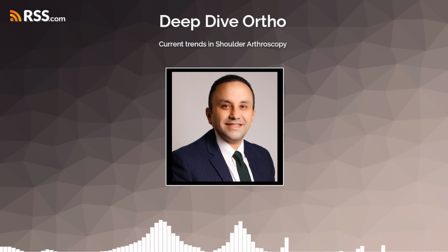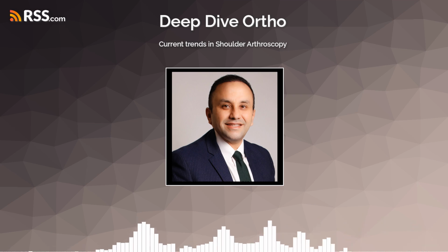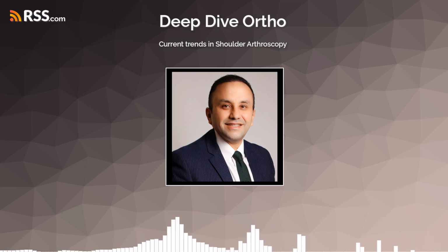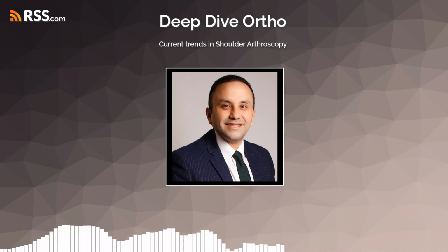They allow us to easily swap different surgical instruments in and out as needed without having to make multiple large incisions or constantly repuncture the skin. Makes sense. They're also crucial for managing sutures during the procedure, preventing them from getting tangled or catching on other tissues. What kinds are there?